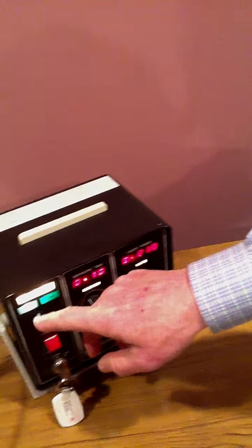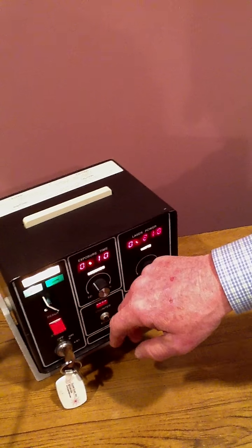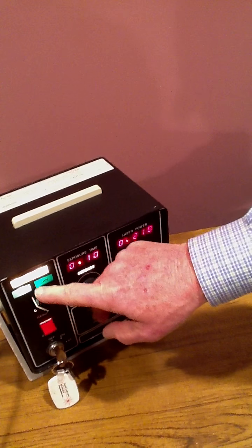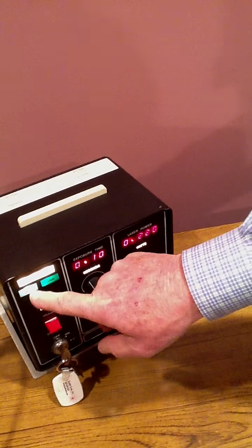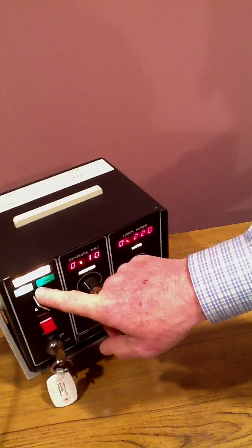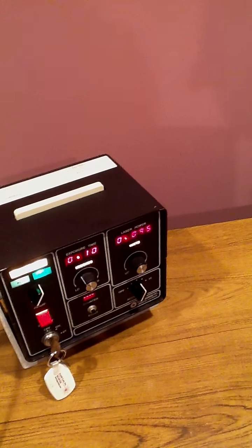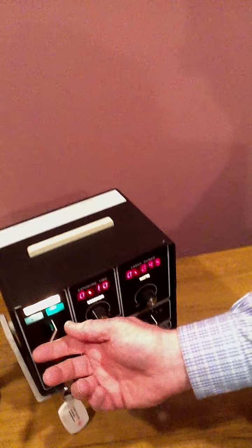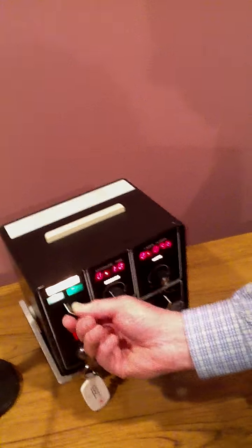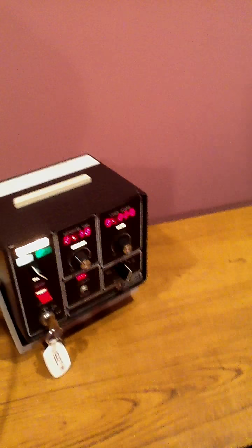Now, there's a blue-green and a green method of using this. For most procedures the blue-green designation works. If you do delicate work around a macula, switch it to the green and that reduces the amount of damage to the retinal layers. But for the purpose of this demonstration, we're going to keep it on the blue-green.